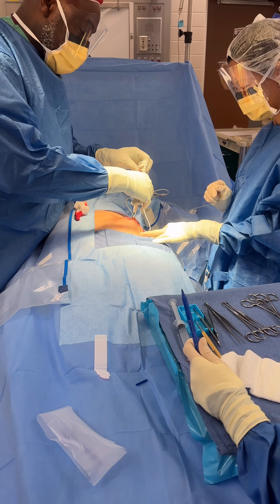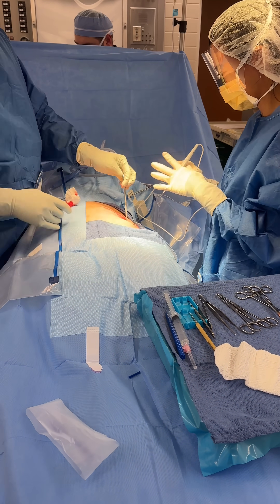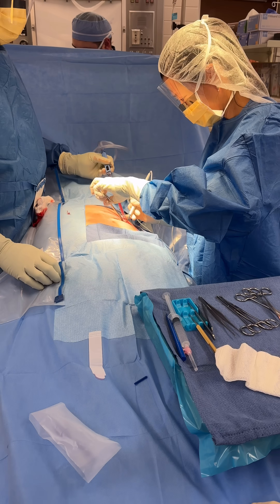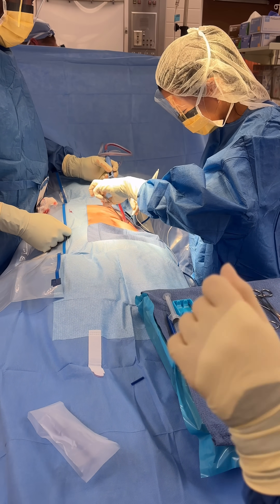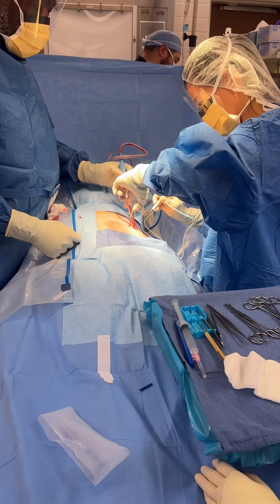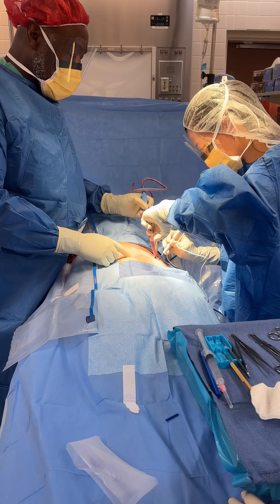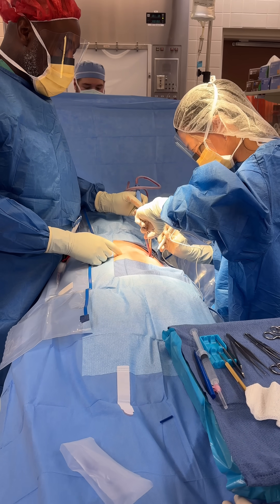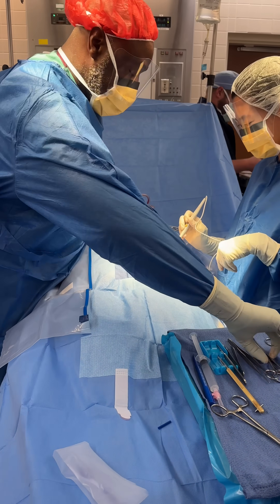Do you want a culture? Okay. All right, you can do your side. How about this specimen cut? We're going to see this whole thing — we're just going to see the hole. Good, look at that. I'll pull it up over here. All right, go with that burn. That's good. Now I'm going to use coag — you can see the purple. Very good. Keep going. Good job.